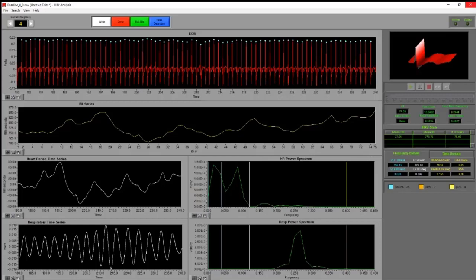Okay, so the next question is based upon the baseline correction, normalizing ECG measures. Typically what we would want to do is get that baseline information, and you can basically subtract that difference of the conditional information from that to normalize the data. You certainly do want to do that if you're doing a between subject analysis, so we can get that starting point for each individual person. And then what we're looking at is the change between that and the stress condition, or how they recover from it.